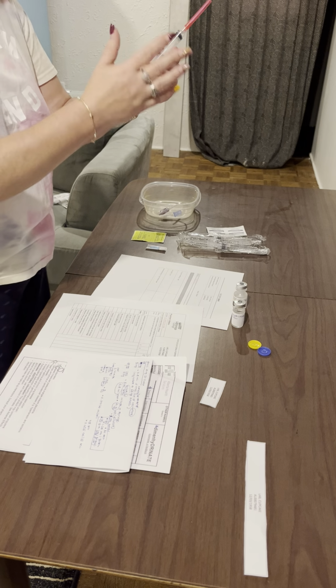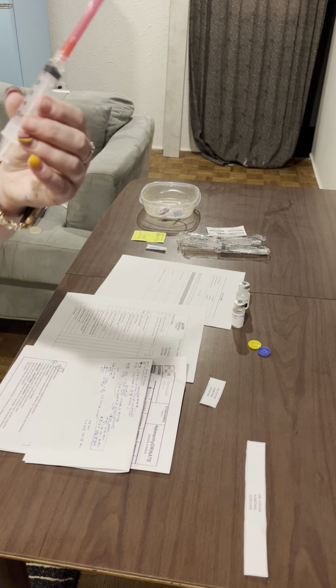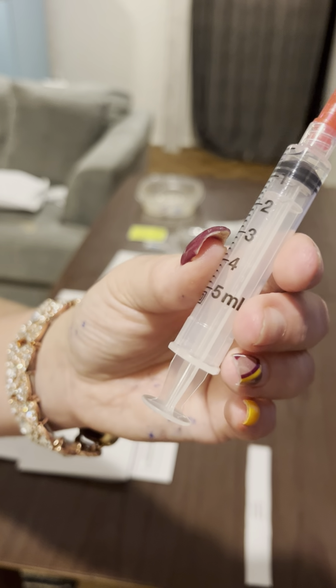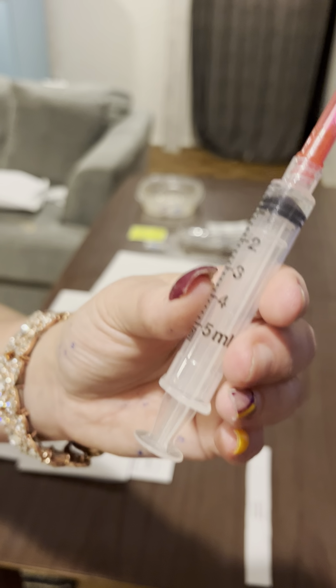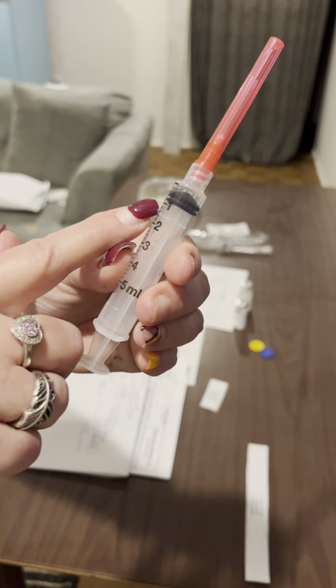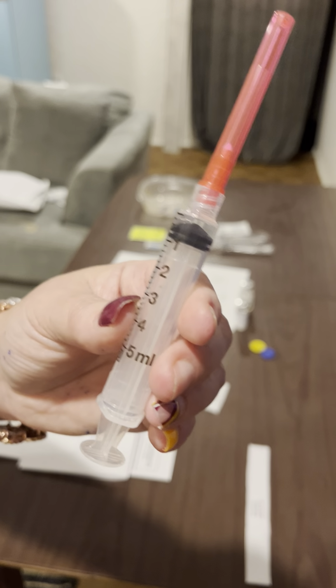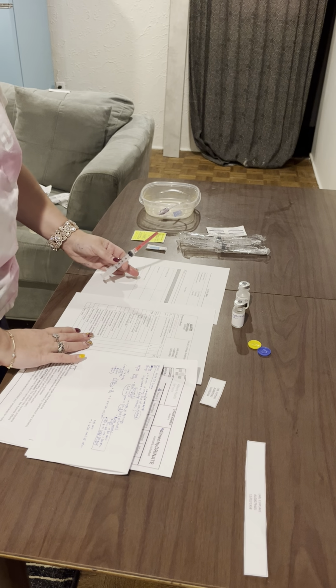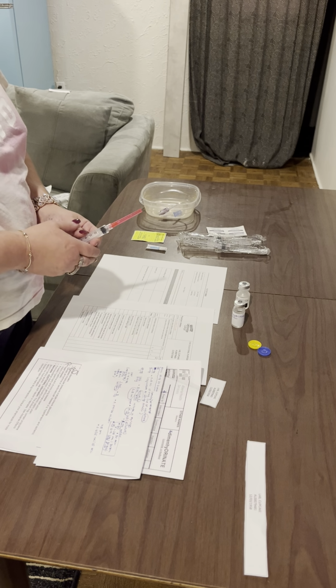We'll check and make sure our dose again is 4.5. It's looking pretty good. No bubbles. So this is the dose, 4.5. Sorry, I keep saying 4.5. It's 0.5. The dose should be 0.5. I drew up 0.5 and it clearly shows 0.5. Okay. So we have the dimenhydrinate drawn up.